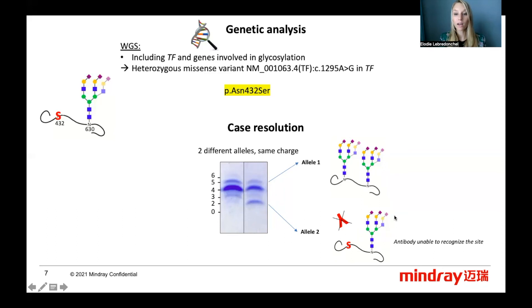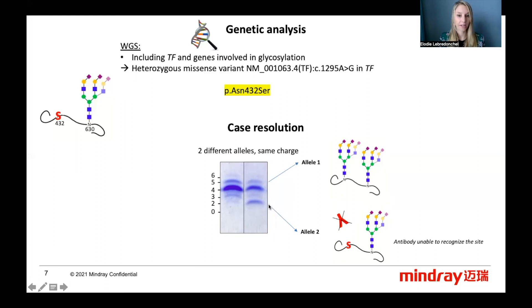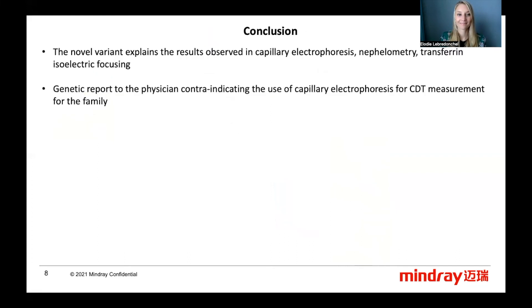Moreover, the antibody of the immunonephelometric method is unable to recognize this site and cannot bind. Overall, the elevation of the 2-sialotransferrin seen here is not due to alcohol consumption. This novel variant explained the results observed in capillary electrophoresis, nephelometry, and isoelectric focusing with and without neuraminidase. A genetic report was sent to the physician to counter-indicate the use of capillary electrophoresis for CDT measurement of the whole family.